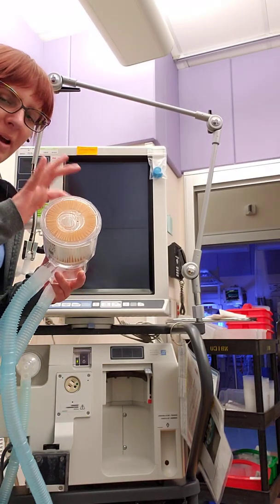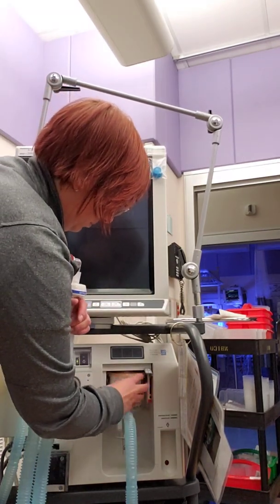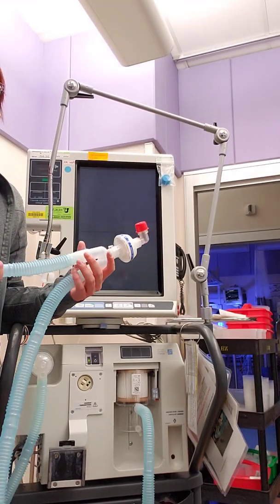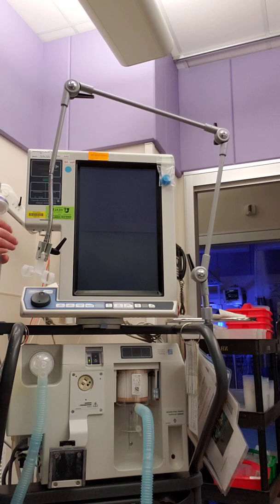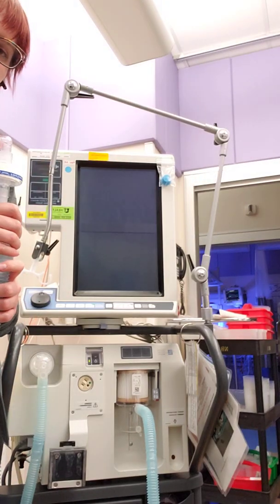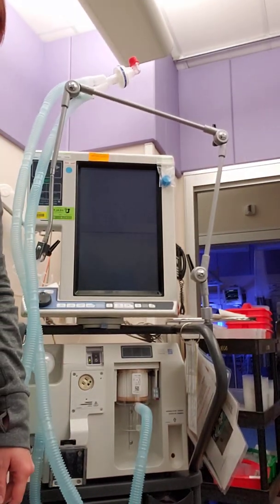So this is typically my first go-to to change if I am not passing an SST and my machine isn't working properly. So treat it with care. Another thing is maybe your circuit's not set up right or something else like that is going on. And that is how to run an SST on the Puritan Bennett. This is, again, part of what will keep our ventilators running appropriately for our patients so that we can give the best care where we can. Okay, thanks guys.